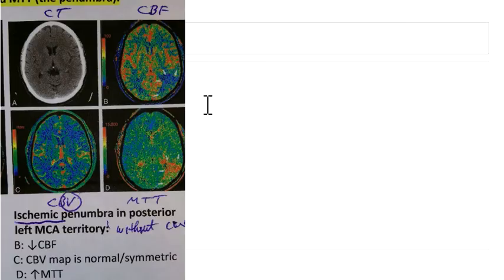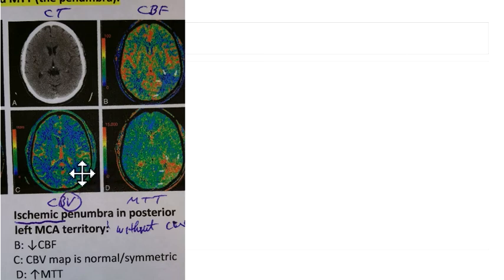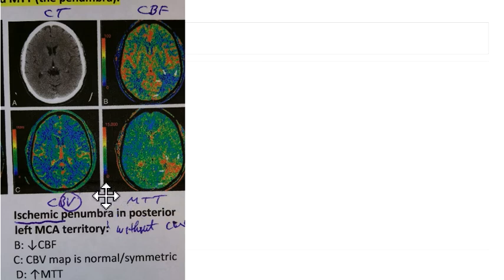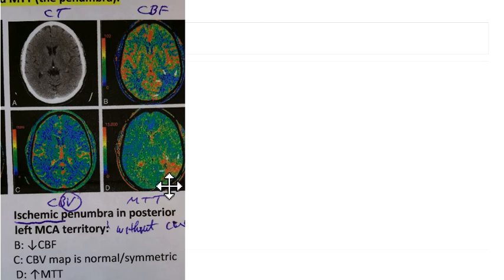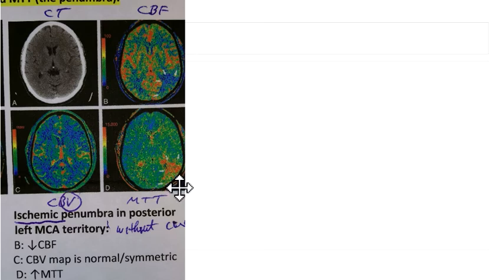Here's another case. Look at all the images and find the defect — it's here on CBF, here on MTT, and nothing on CBV. Now compare the CBV to the MTT. On CBV there is no defect, so no core infarct. On MTT there is a defect. That means it's only a mismatched defect, consistent with hypoperfusion or potentially reversible ischemia with no core infarct.